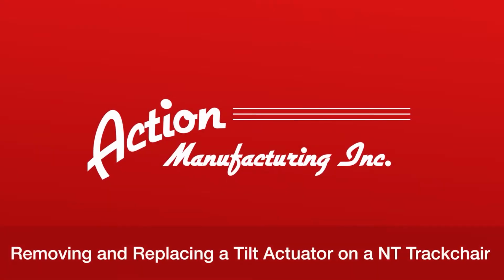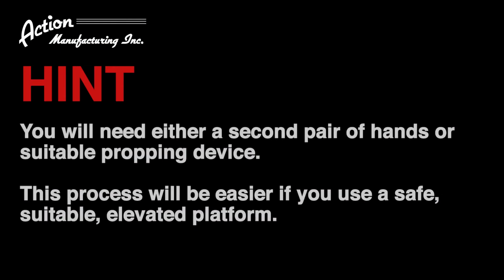In this video, we will illustrate and explain how to remove and replace the tilt actuator on an NT Trackchair. There are two items of significance before we begin. First, you can identify a solid, elevated work surface. This project, like most, becomes a lot easier.